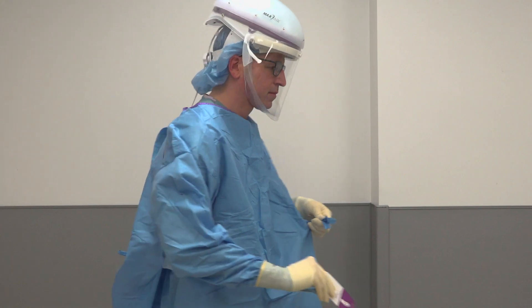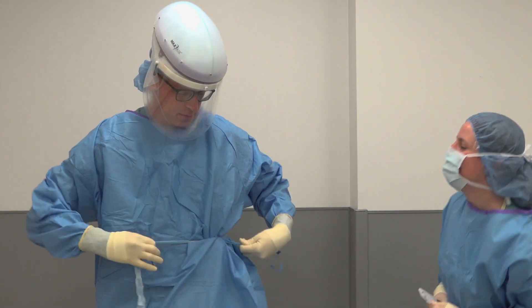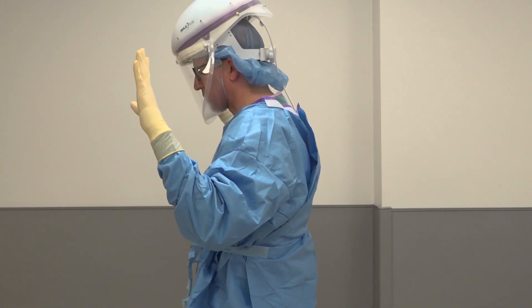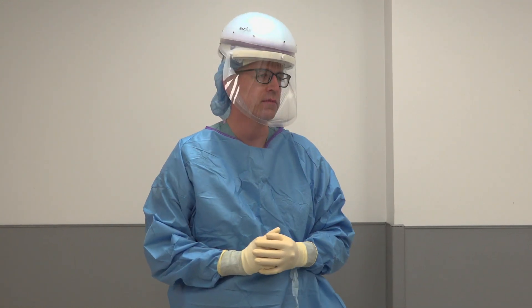Lastly, do a check of your gear with a buddy. Check that the gown is not torn and gloves are intact. Check that the helmet has three green LEDs and is tucked well under the chin. Check that the shield is fixed to the three attachment points.